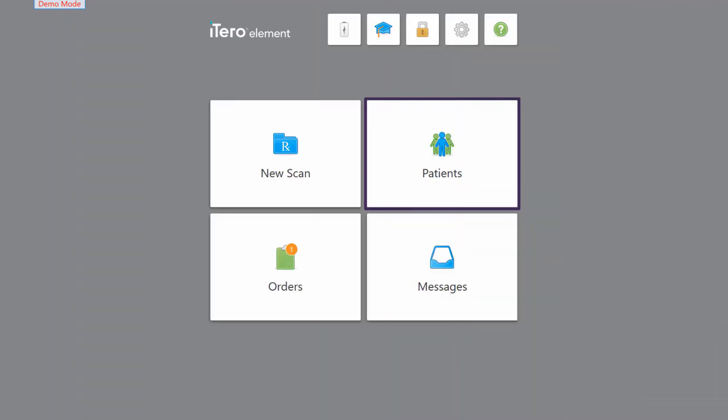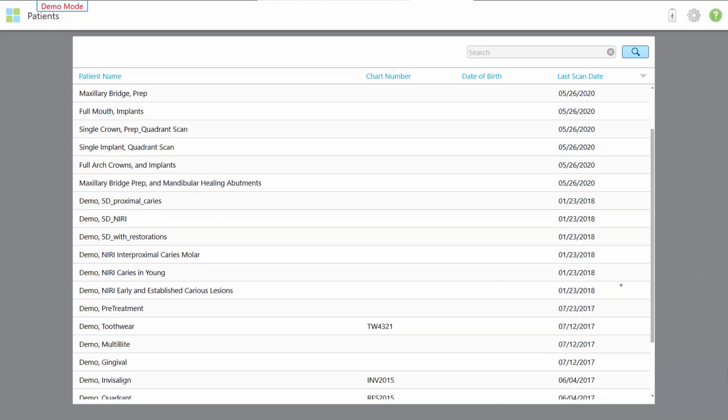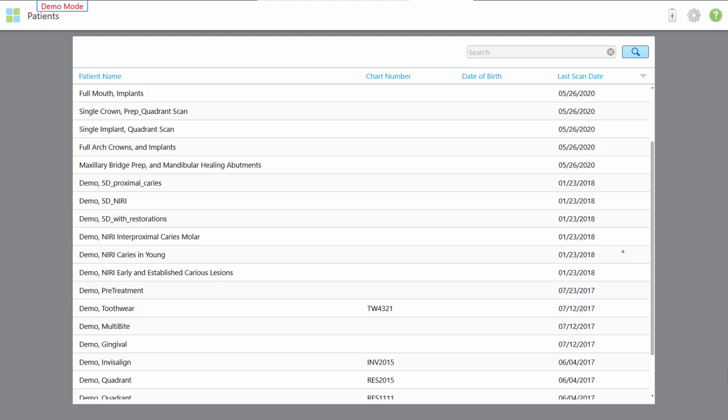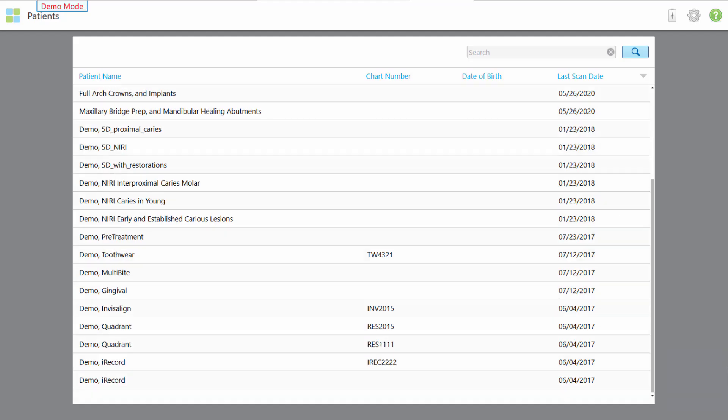To explore cases, tap patients. These demo cases showcase iTero scanner clinical capabilities. The patient name indicates the type of sample case.